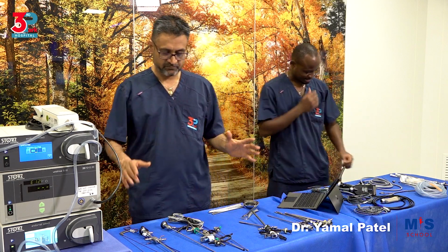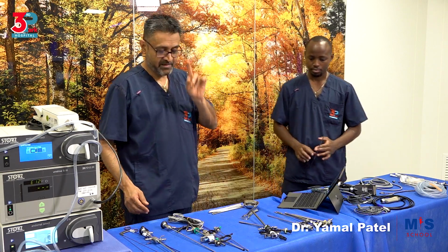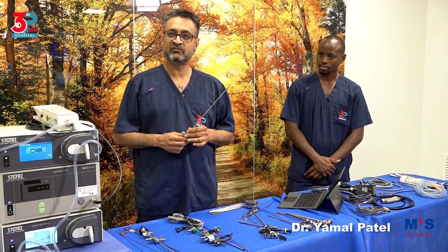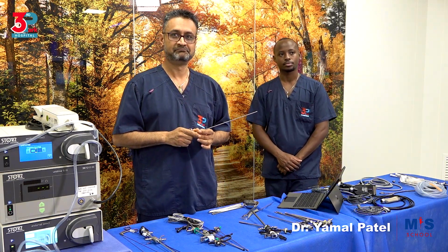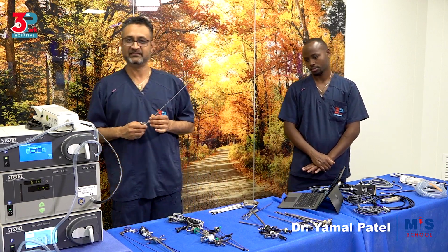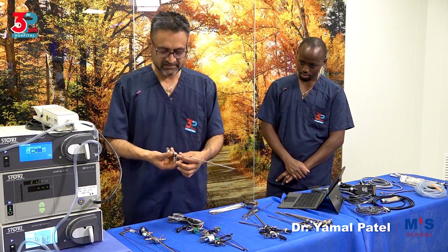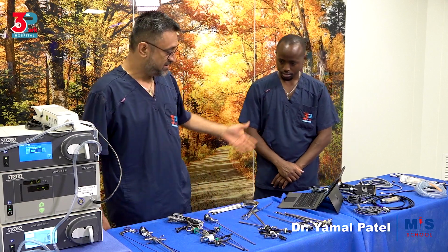So that forms your resectoscope. Remember what we said? The angled scope that you use for the resectoscope is, did you get it right? 12 degrees, not a 30-degree scope. So this is a 12-degree 4 mm scope.